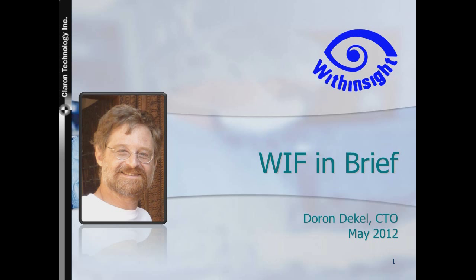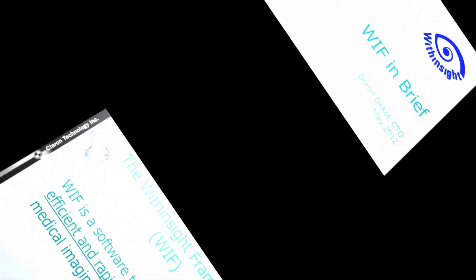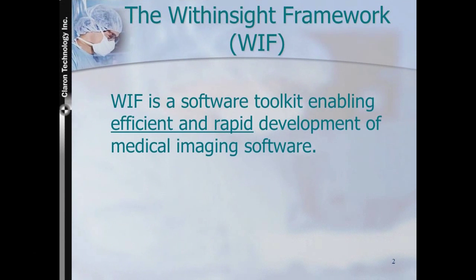In the next few minutes, I'd like to give you a sense of what our WIF product is all about. WIF was designed to accelerate the development of software that handles medical images. Such software typically aims to put image data within sight, that is, to visualize it, or to extract useful information from the data with insight, applying computer vision algorithms to it.